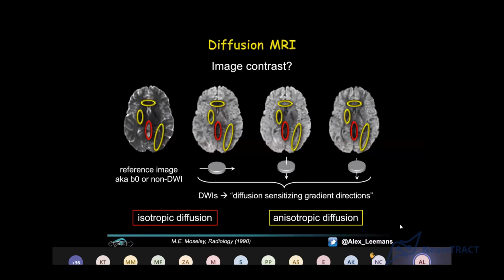And then I'm showing you these yellow areas. If you know a bit about anatomy, the top one is indicating the genu of the corpus callosum, part of the corpus callosum connecting the left and right hemispheres in the front of the brain. Then there's the anterior limb of the internal capsule in the middle, and the one at the bottom in the image is reflecting part of the optic radiation. So what I've been mentioning are parts of the white matter structure.